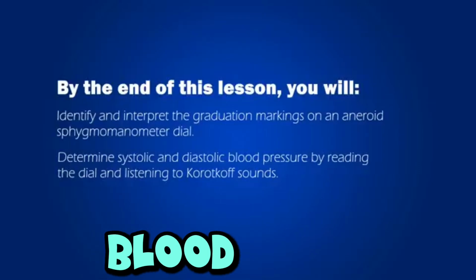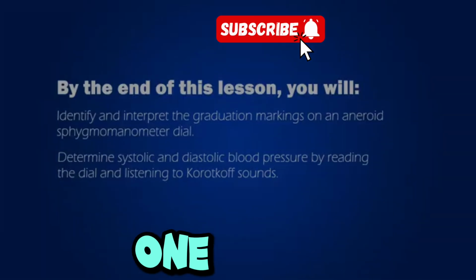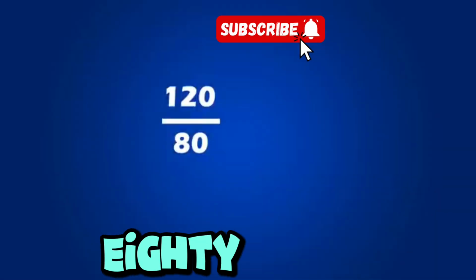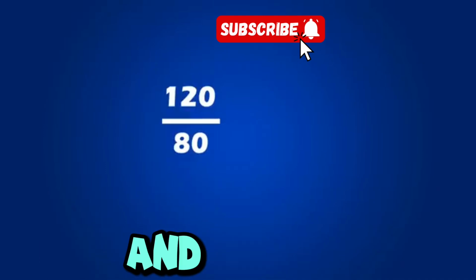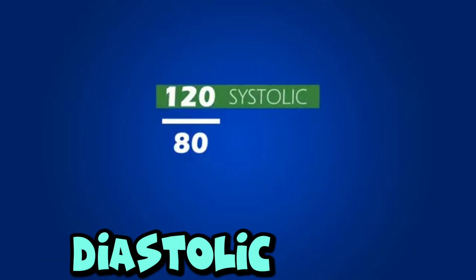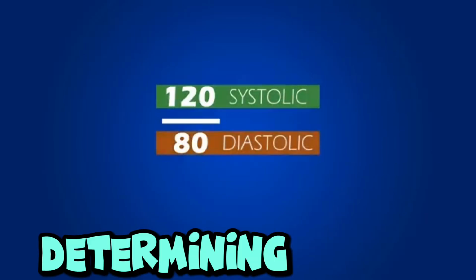If you have ever had your blood pressure taken, you likely noticed that the results were stated as one number over the other number, such as 120/80. In this case, 120 represents the systolic pressure, the number on top, and the bottom number, 80, represents the diastolic pressure. Let's take a close look at the dial used for determining such a measurement.